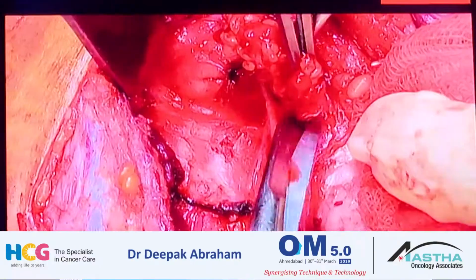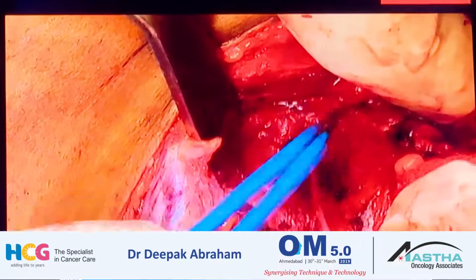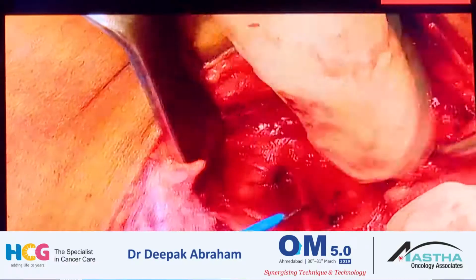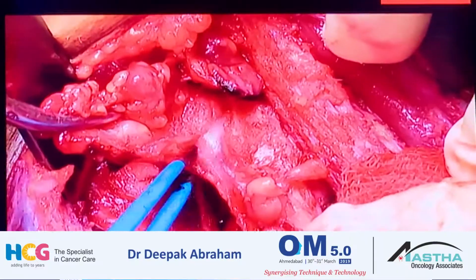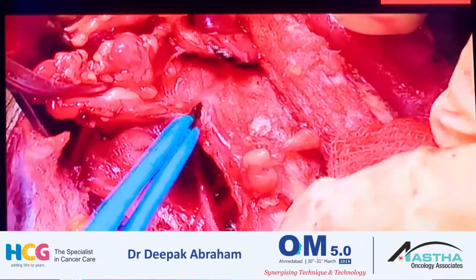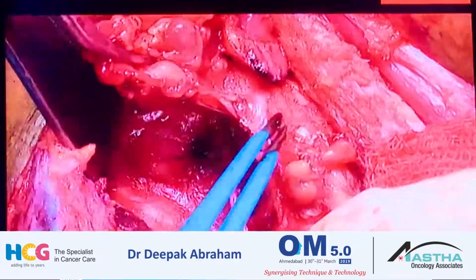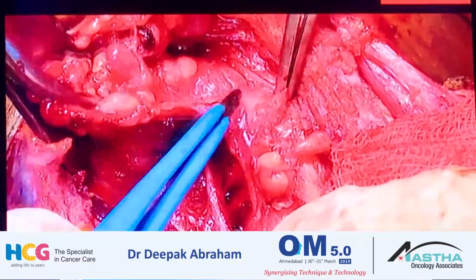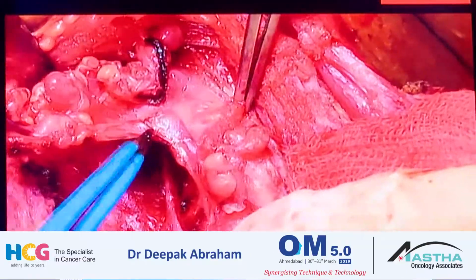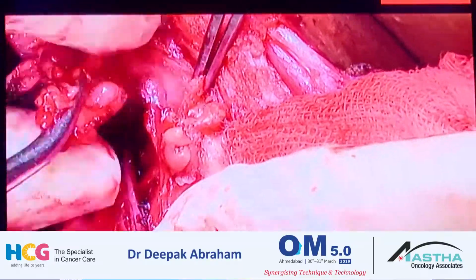So I use a combination of a bipolar set on low settings along with a vessel sealing device to do this. And I can tell you, doing a thyroidectomy, especially the neck dissection, with a vessel sealing device has brought down our operating time by 1.5 hours. In earlier days we used to take a long time to do a big dissection, but this has really improved our timing. And for us that's a big thing because operating time is a premium.